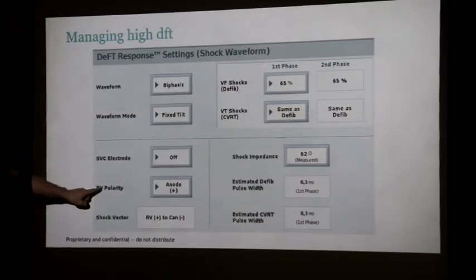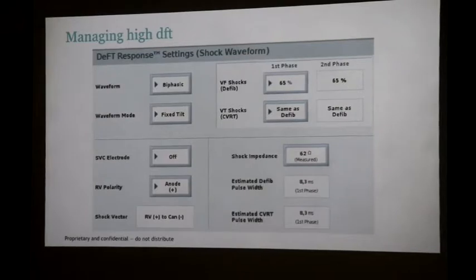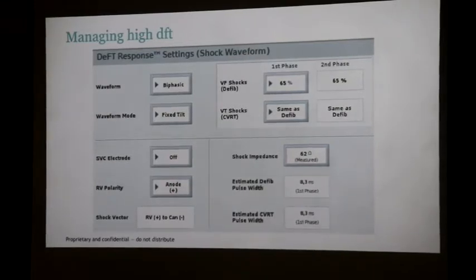And that's the thing that everybody wants to change. Yeah. Not on Abbott devices, okay? Abbott devices are anodal, Medtronic devices are anodal, Boston devices are cathodal. So on a Boston device, you might want to change it.